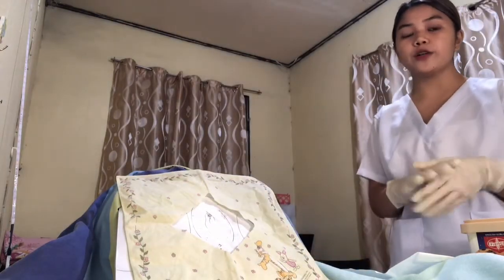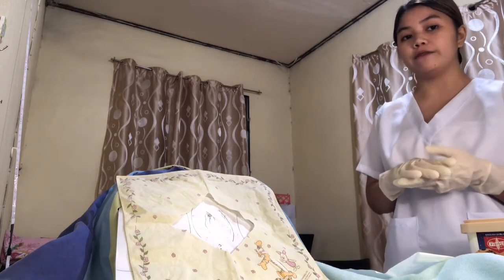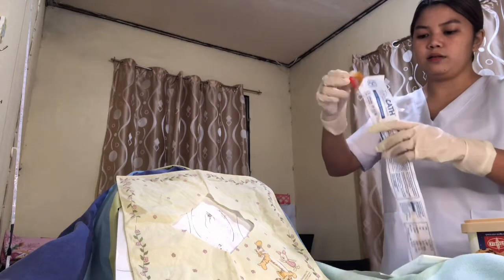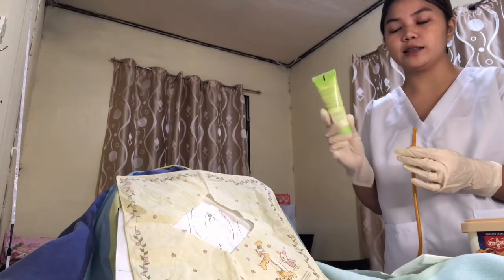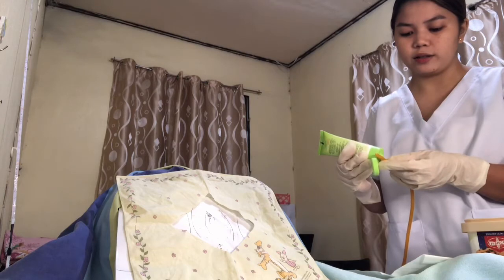So after that, we will lubricate the catheter for about 1.5 inches, being careful not to plug the eye of the catheter. Lubrication reduces friction and prevents urethral trauma, thus reducing pain upon insertion. So this is the catheter. I'll open it. So this is an improvised lubricant. So we'll put some lubricant.